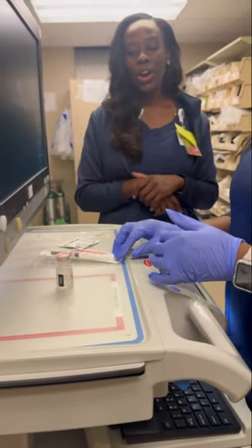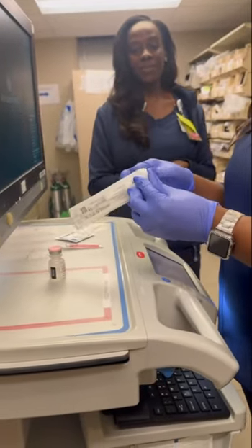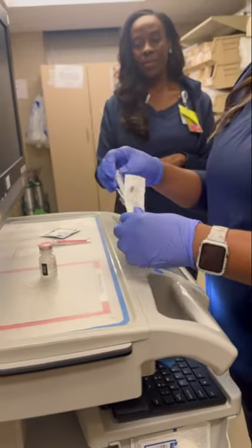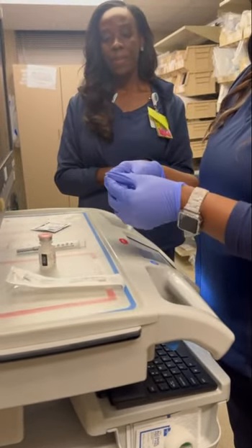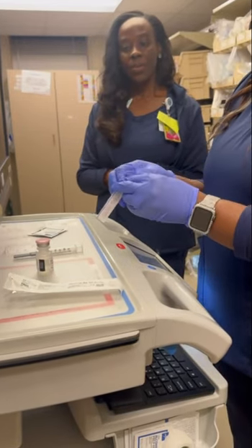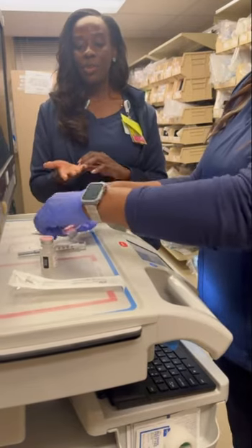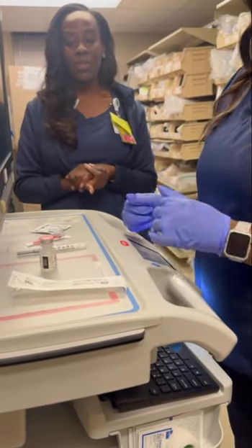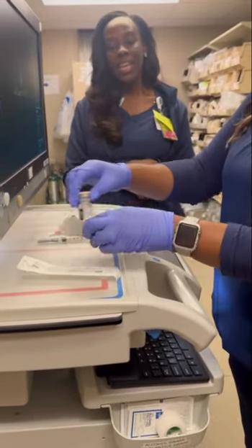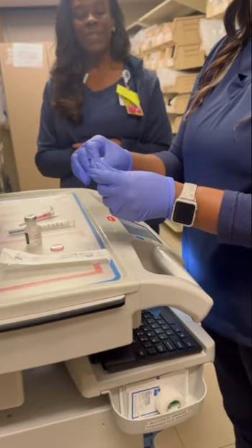At this point, we will open up our syringe and prepare our workstation. It's good to have your workstation at an appropriate working height for you as well. We'll get our alcohol and pop open the top of the medication vial and scrub that gray area for at least 15 seconds.